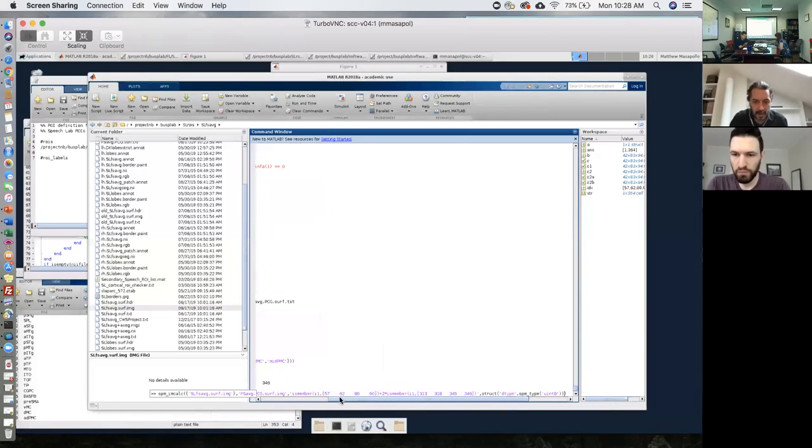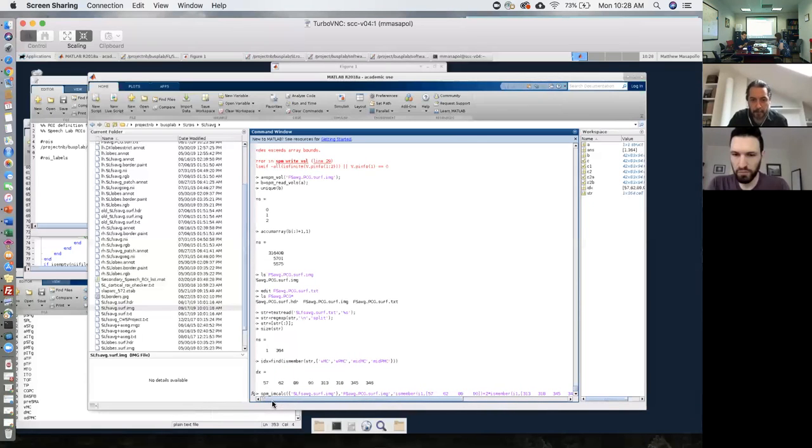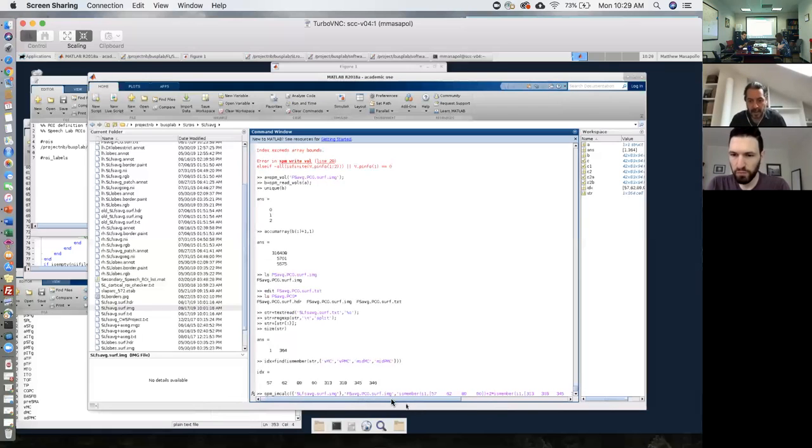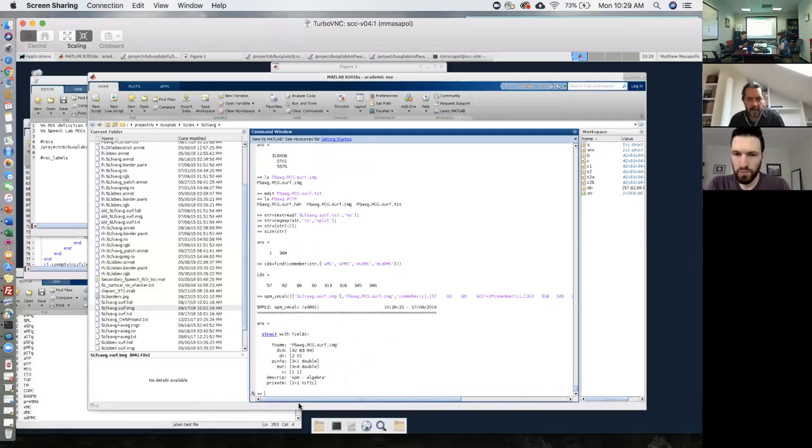And we did it in this convoluted way because we wanted to separate. We really didn't want to combine all of those into a single ROI. We want to combine this 4 and this 4. We could have done that separately, creating 2 different files, right? One for the left hemisphere and one for the right hemisphere. We just did it a little bit more complicated, perhaps unnecessary in this case. We created a single file that contained those 2 ROIs. We just gave ones to the first, the left hemisphere, and 2 to the second one. So we used that syntax. And then we did that trick.